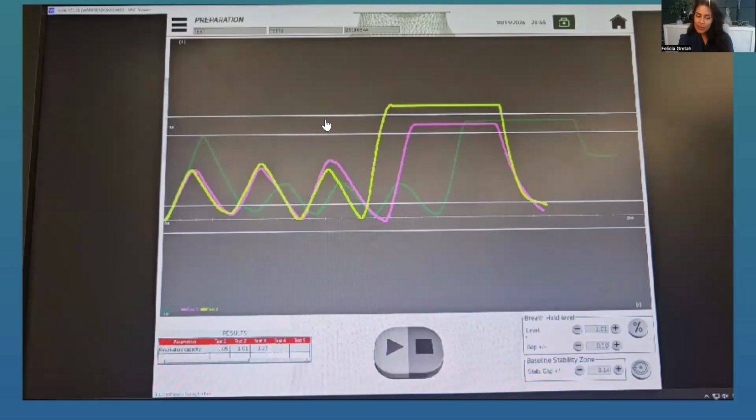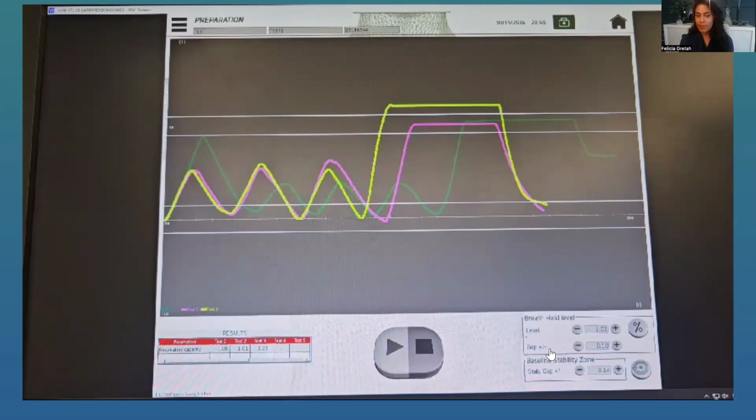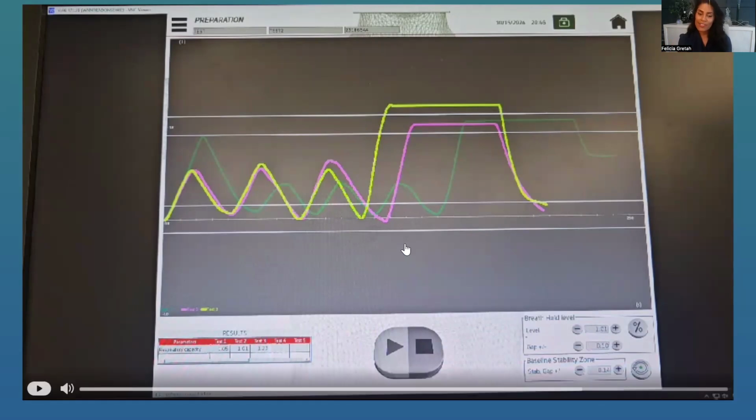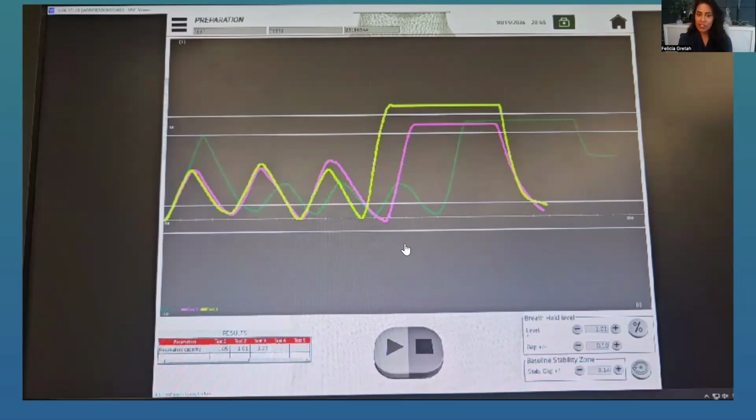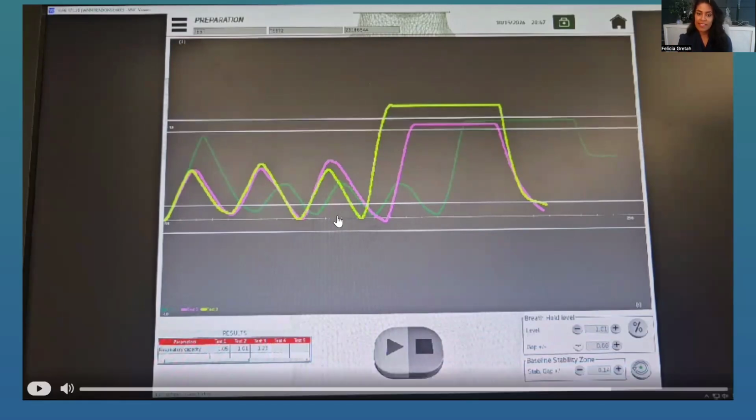We think that's a little bit too thick, so we like to reduce this gap. So on the bottom right in this corner, you have a few options. There's an option for the gap plus or minus. It's generally set to 0.1. I don't know if that's a default for all systems, but it is for ours. So we reduce that to 0.05.